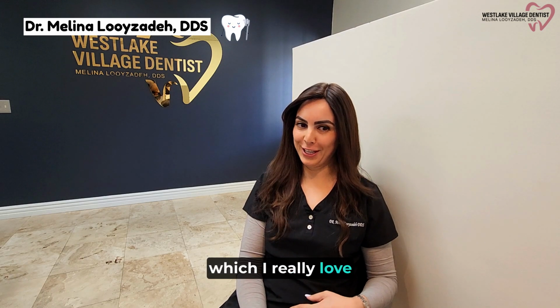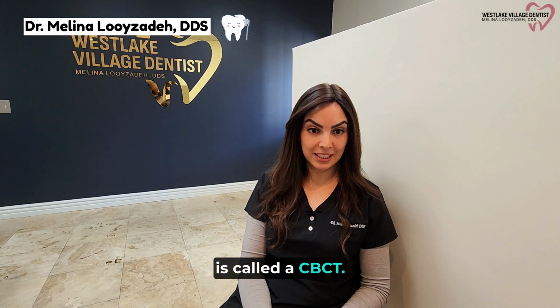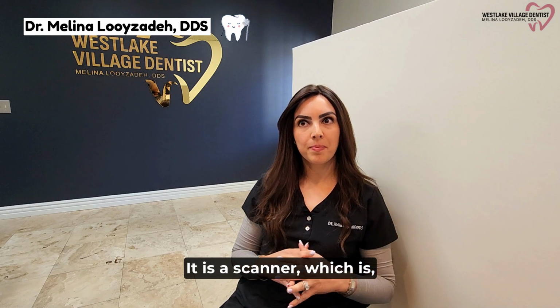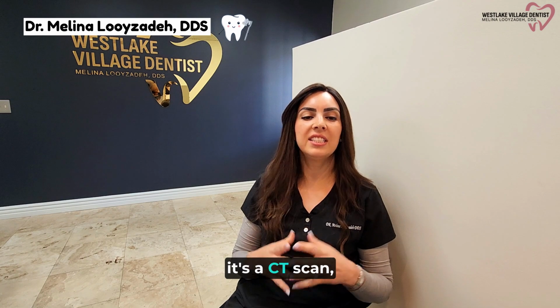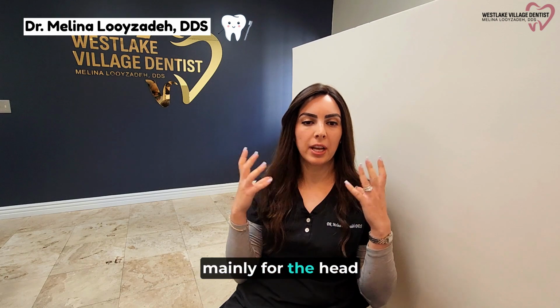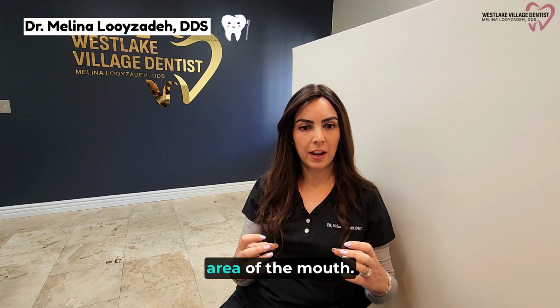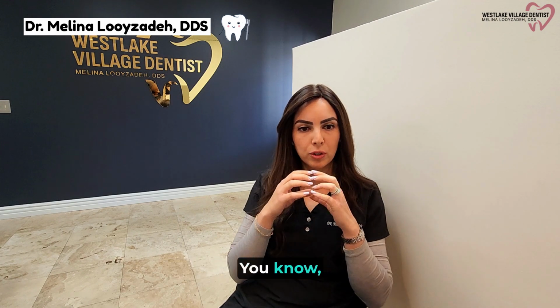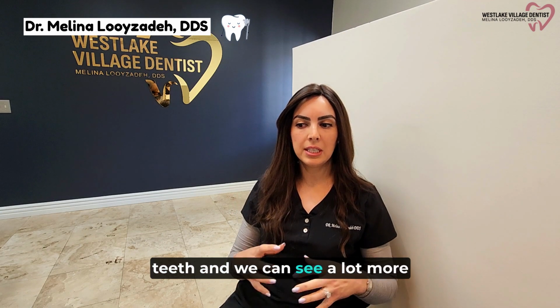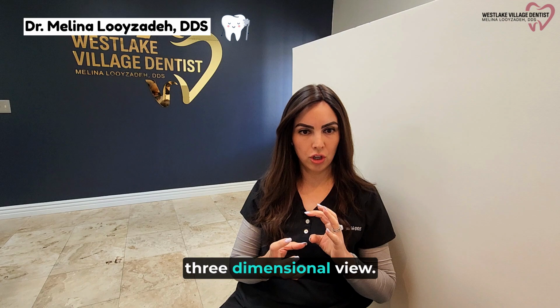Equipment which I really love at the office is called the CBCT. It is a scanner, which is a CT scan, really. What it does is that it's mainly for the head and the neck, but we focus it on a specific area of the mouth. We generally just take all the teeth, and we can see a lot more than an X-ray can see in a three-dimensional view.